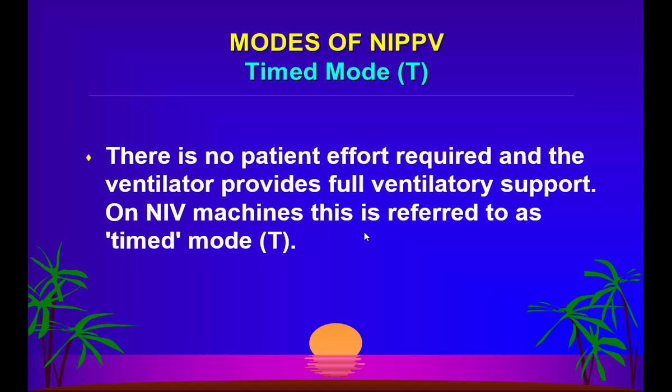What you do is you put them on assist control mode, pressure control mode, or maybe you've tried volume control mode. Fix the mask with a non-vented mask and try and use them, right? But if a patient is requiring timed non-invasive ventilation, again these are the patients who should be on a ventilator rather than fiddling with these patients. Intubate them, put them on assist control, and when they are fine, maybe then wean them off onto non-invasive ventilation.